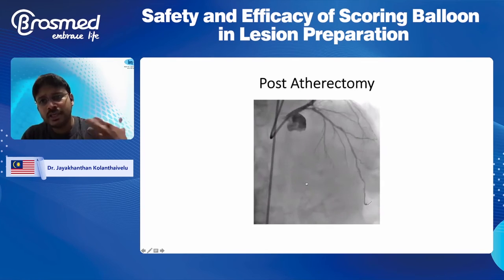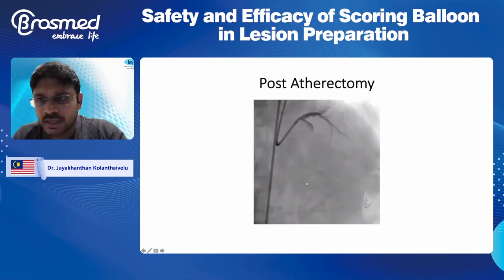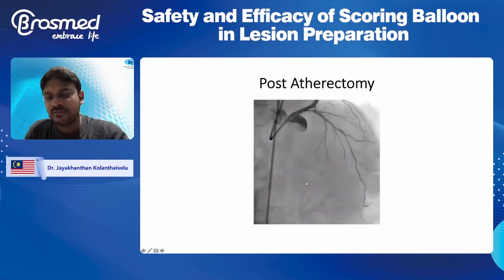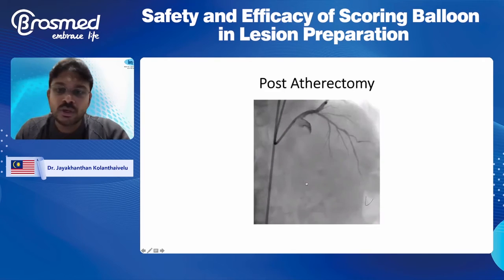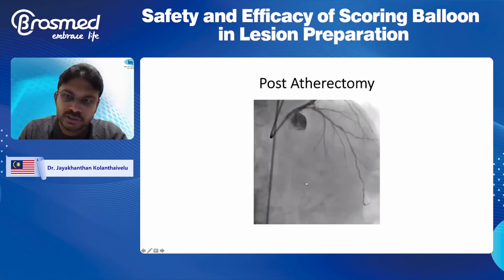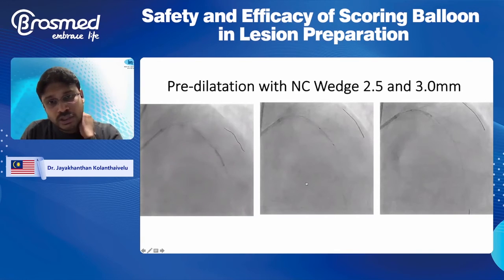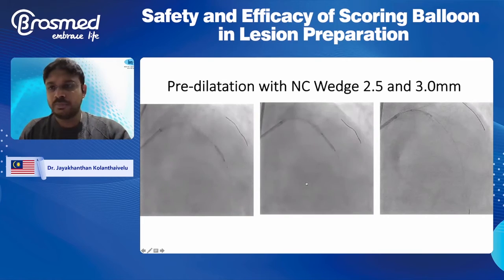So in this case, this is post-atherectomy. There could be an argument, why not just use an NC? But if I have an NC scoring, why not? Because a lot of times with long lesions like this, not in this case, but in long lesions, we do a hybrid with DCB distally, stent the proximal, and then we get out with quite good results. So we initially took an NC 2.5 Wedge, and the balloon opened beautifully.